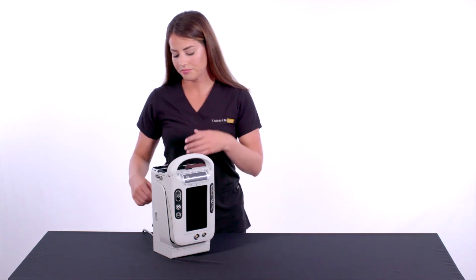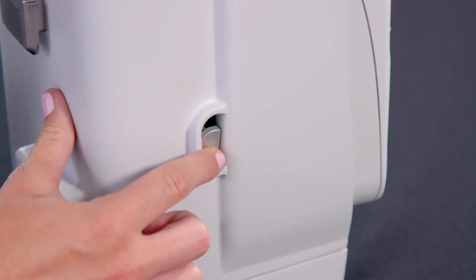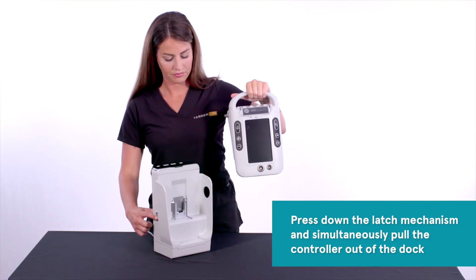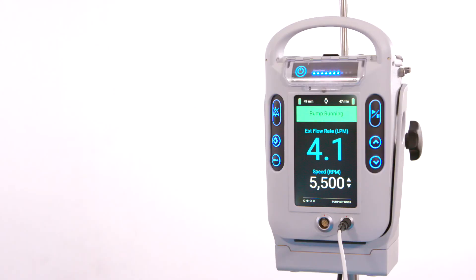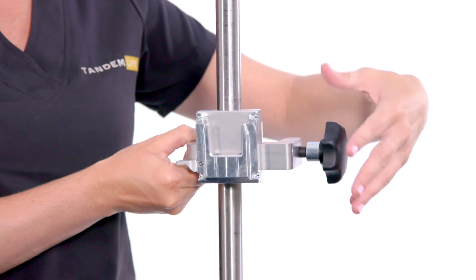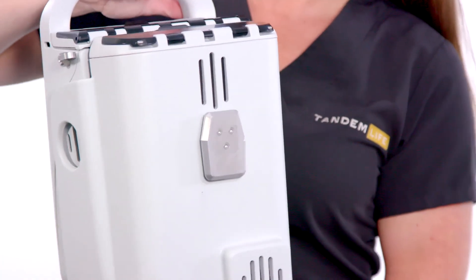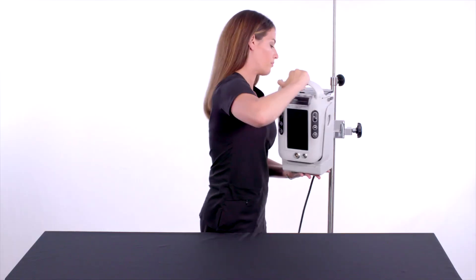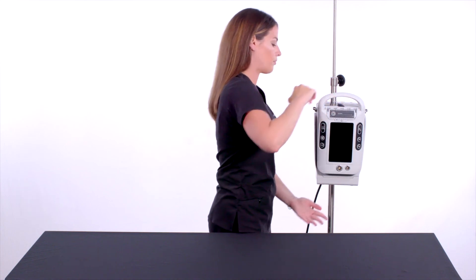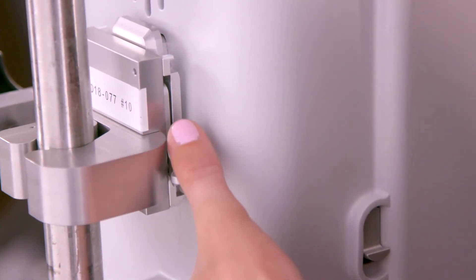To remove the controller from the dock, locate the latch mechanism on the left side of the dock, press down the latch mechanism and simultaneously pull the controller out of the dock. To attach the dock and controller to an IV pole, first attach the IV clamp to the IV pole and tighten the clamp firmly in place. Next, find the mounting plate on the back of the dock and slide it into the mounting bracket located on the IV clamp. To remove the dock and controller from the IV clamp, find the lever located on the mounting bracket, push down and simultaneously lift up on the controller handle.